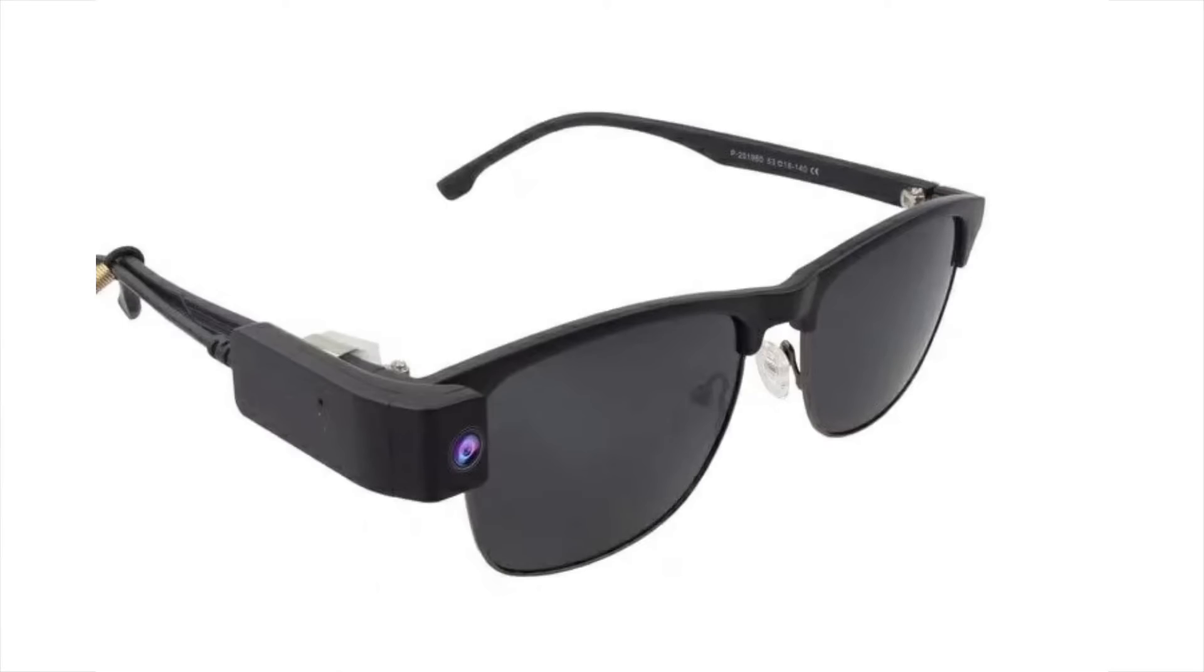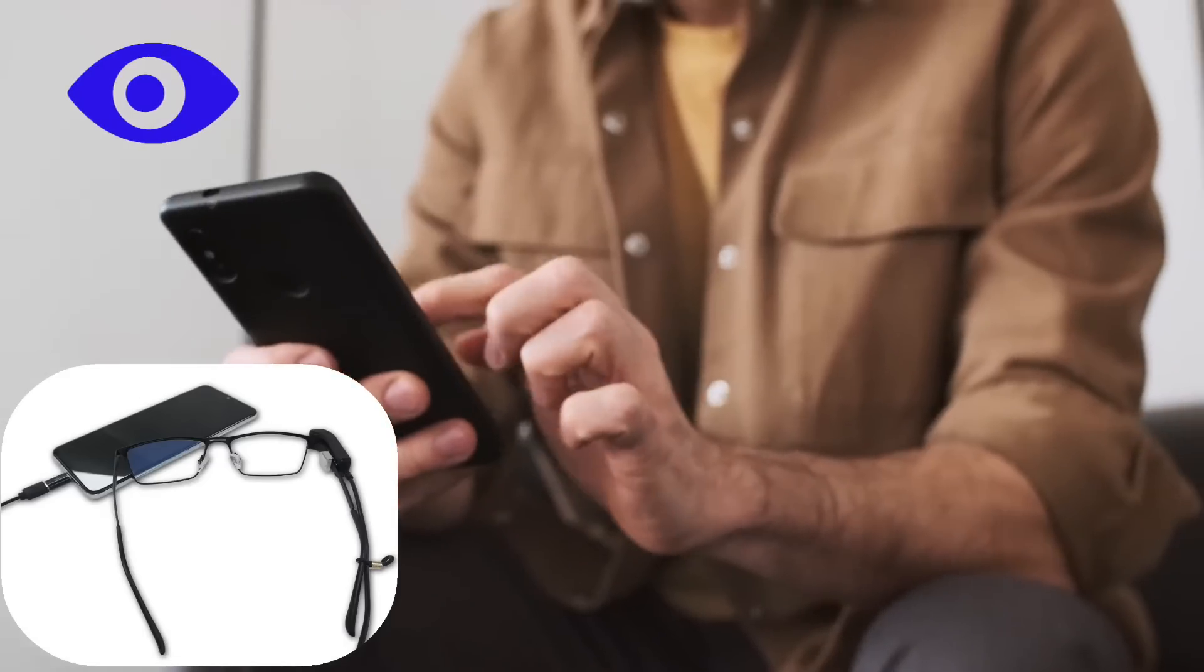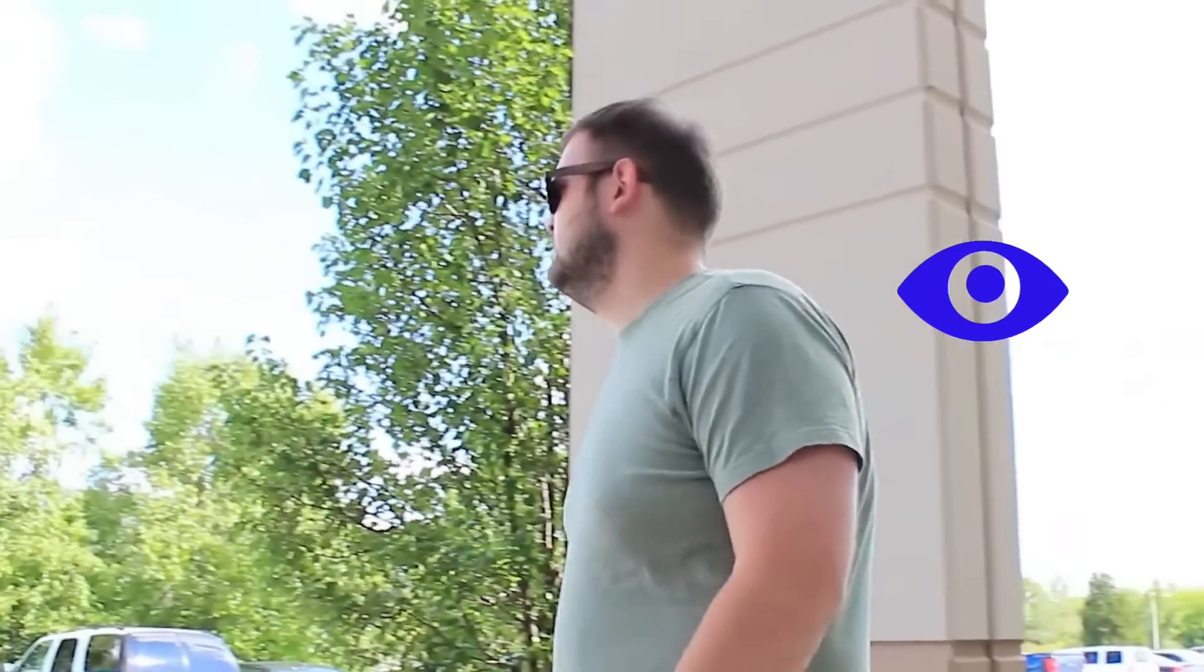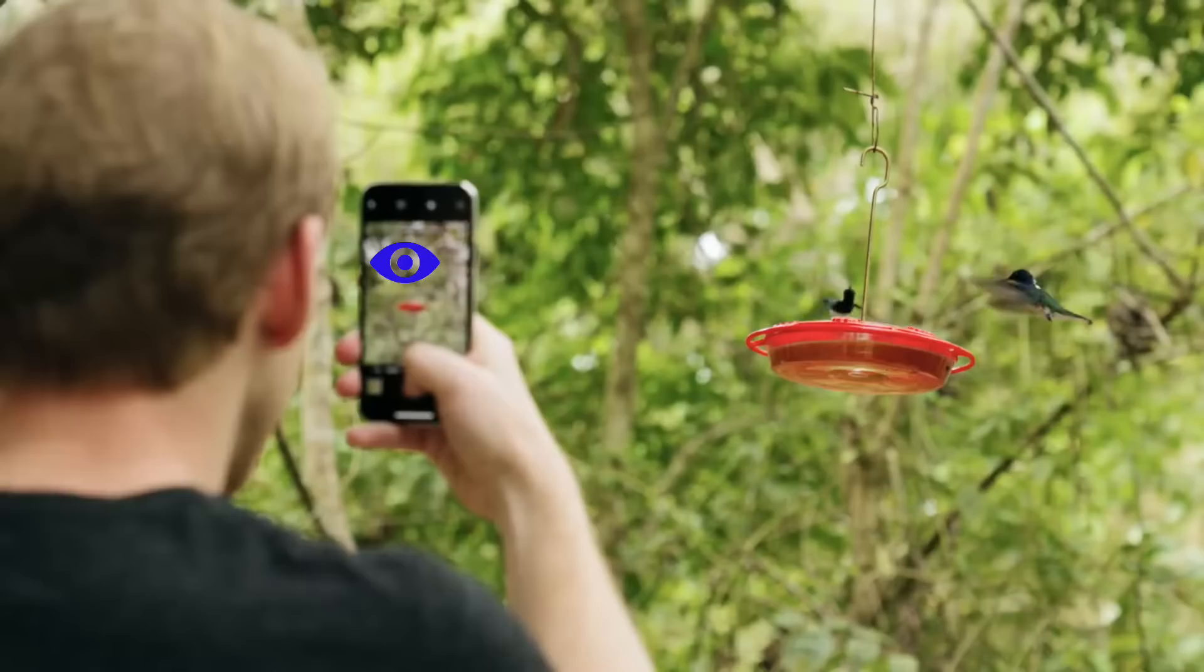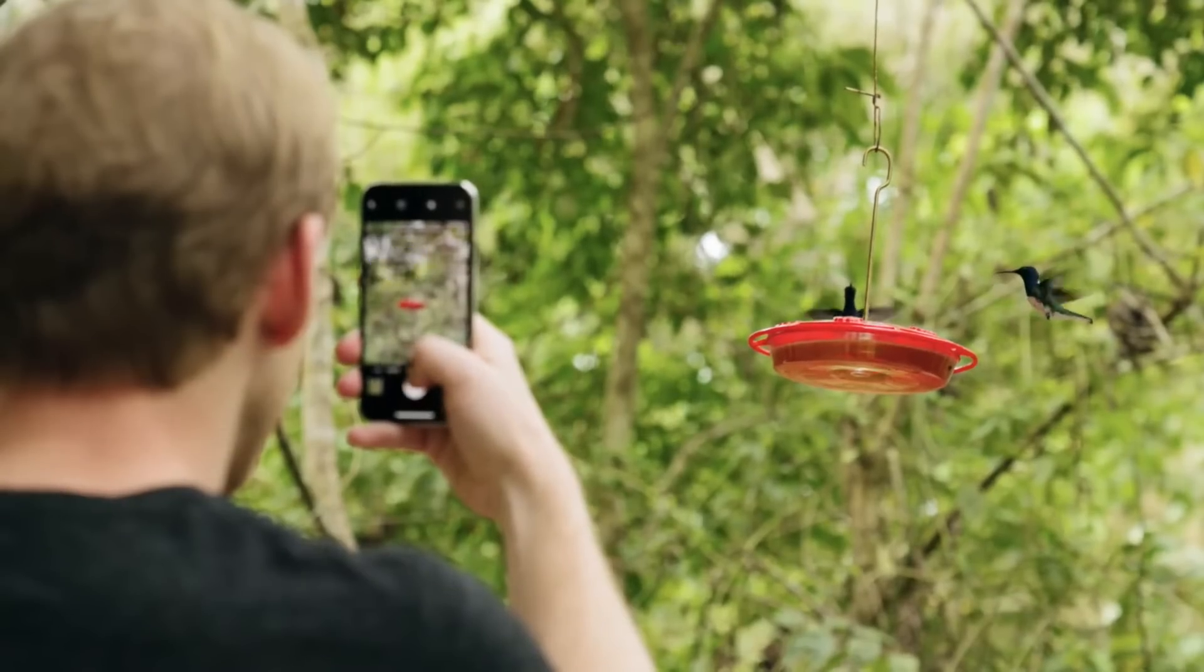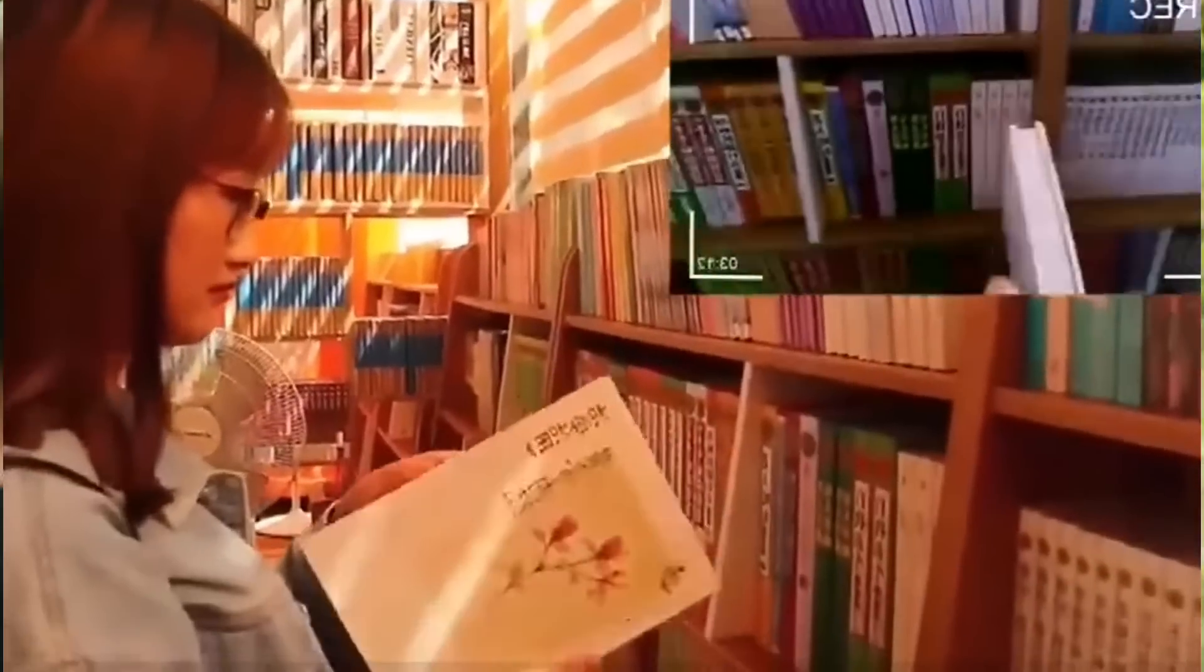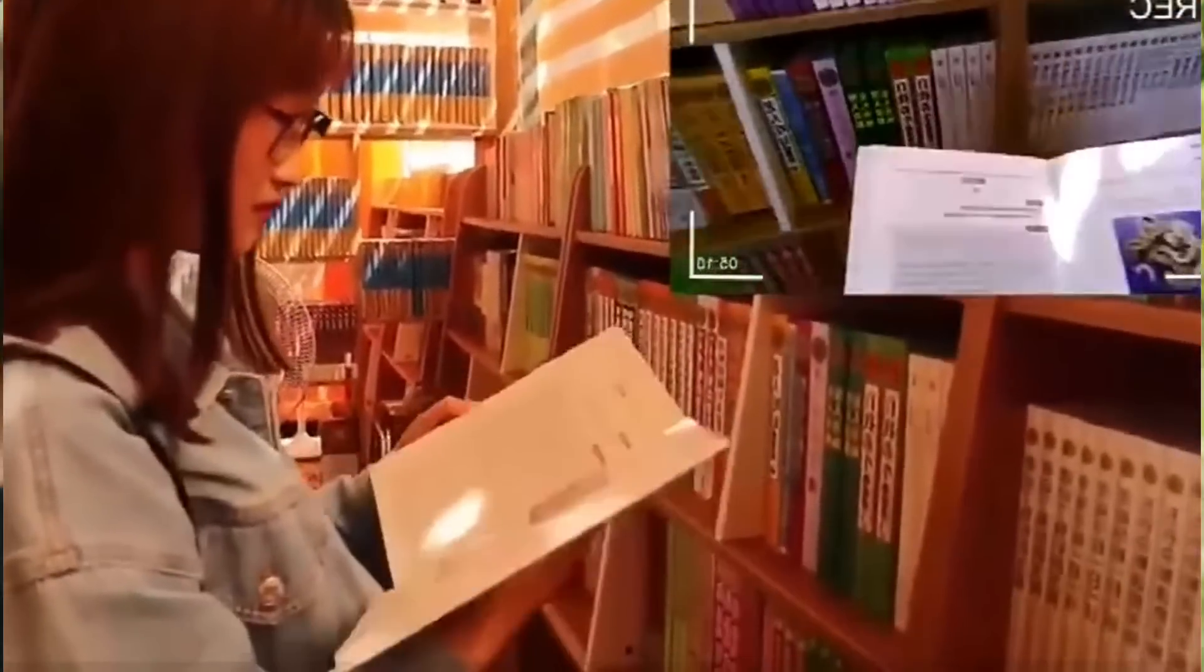An optional wearable camera attached to glasses and connected to the phone captures images of your surroundings. The AI-powered app processes the images and speaks the recognized results to you.